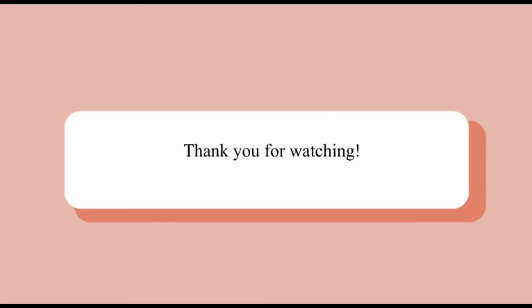So my patient is satisfied with continuous ambulatory peritoneal dialysis because it encourages self-care and independence and frees him from hospital-based treatment. On top of that, he can travel if he wants to, and with the Swan Neck pre-sternal catheter, he can continue to enjoy his bath. Quality of life is good because he has a better psychological acceptance of the exit site.